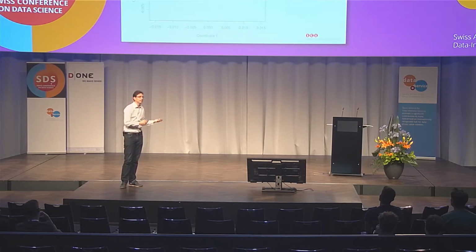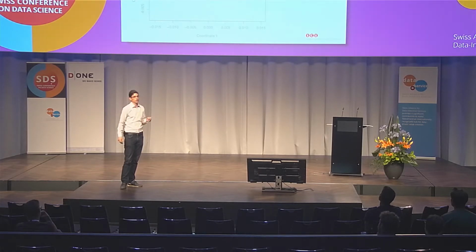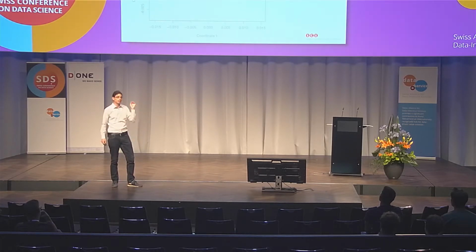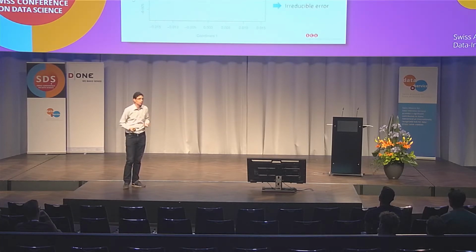So we have 3 samples of the labels of the test set, and you can see them here on this plot. Interestingly, there is variability in the ground truth. This ophthalmologist labeled the test set images differently each time. And this is an interesting case in machine learning. In machine learning, we call such a situation one where we have an irreducible error.